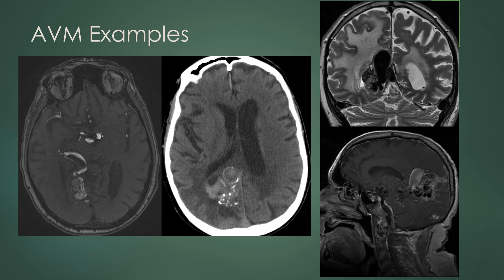More examples of AVMs. Here on another MRA you see the vessel from the PCA supplying the nidus in the right occipital region. On CT, here are those coarse or popcorn calcifications within the nidus, and you can see some aneurysmal dilatation, usually of the venous outflow. On a T2-weighted image, you can see the flow voids of the nidus as well as the aneurysmal dilatation of the venous drainage, with more gliosis and edema within the surrounding brain parenchyma. Here it is on a post-contrast sagittal T1 showing the nidus as well as aneurysmal dilation of that venous drainage.